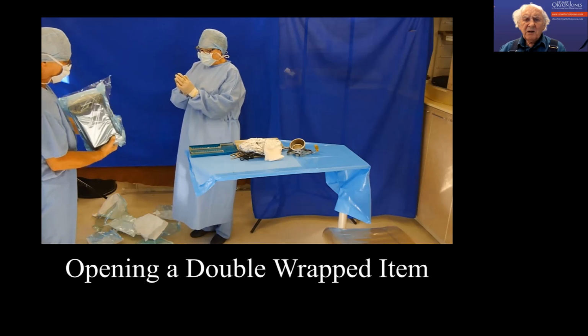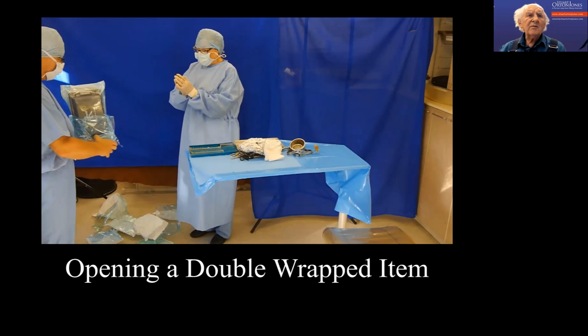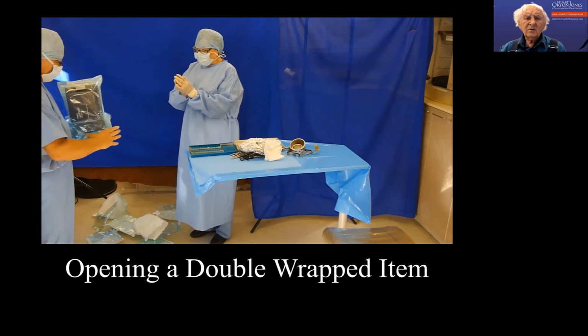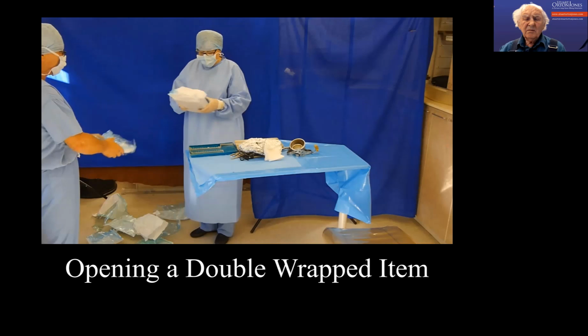This Mayo table, which is attached to the base of the chair, has been absolutely wonderful. This is the implant kit.